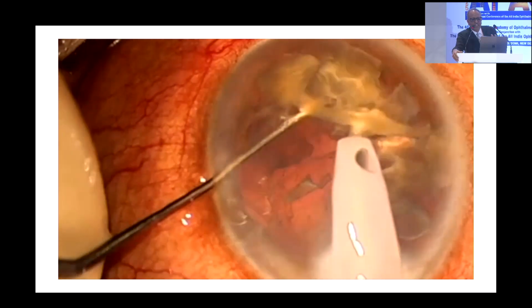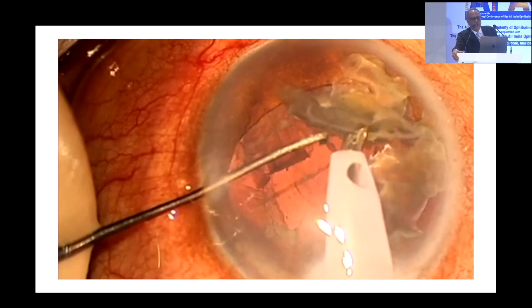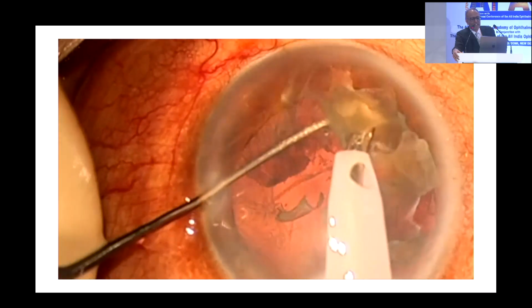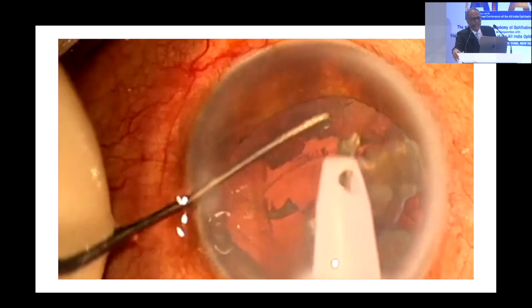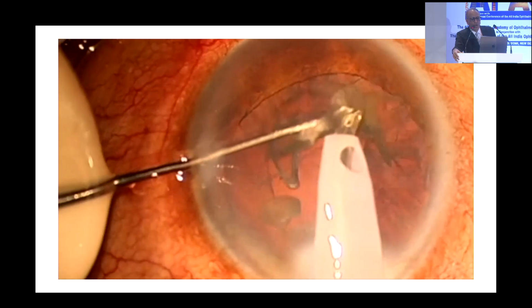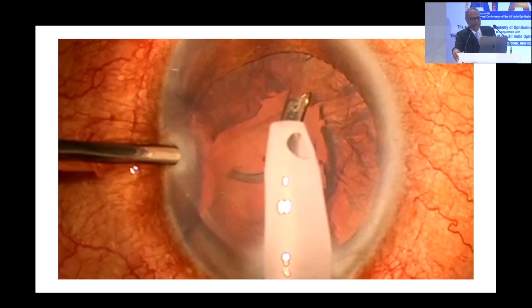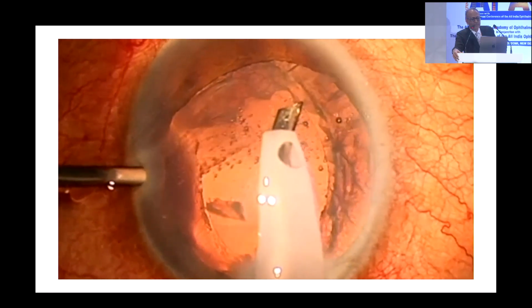So using these fluidics with stable chamber settings, you are able to transform the foe into a friend, and you will see while this is being done in a very guarded way, these three small nuclear fragments would not go back whatsoever. So the process is continuing, and this is the last piece. Stable chamber settings. These three nuclear fragments are already there.